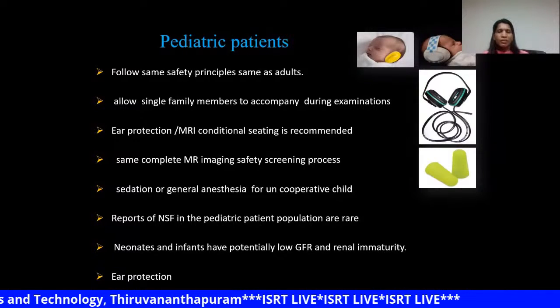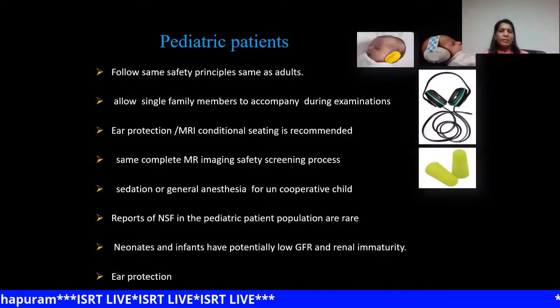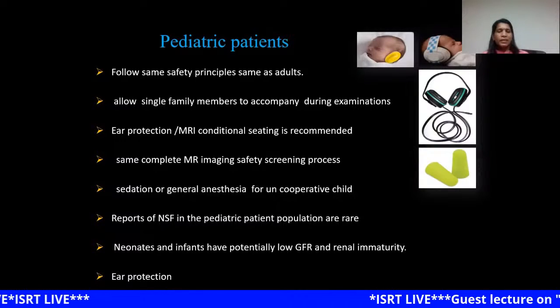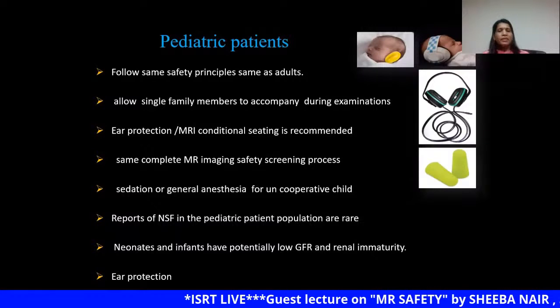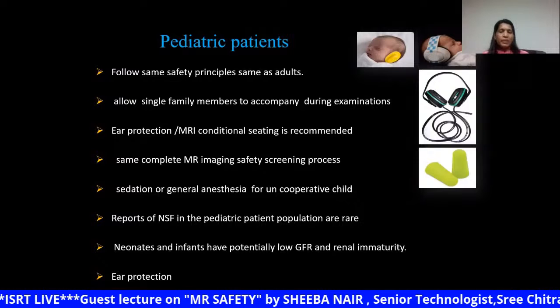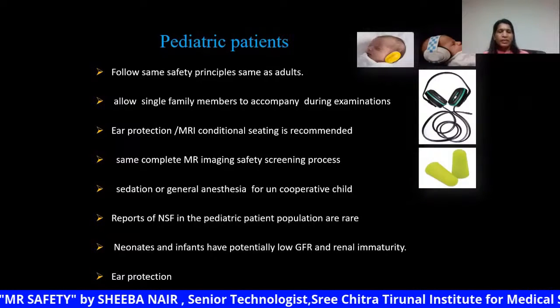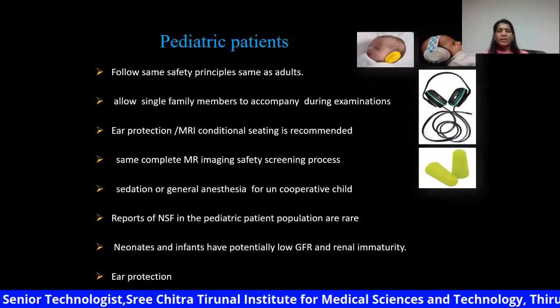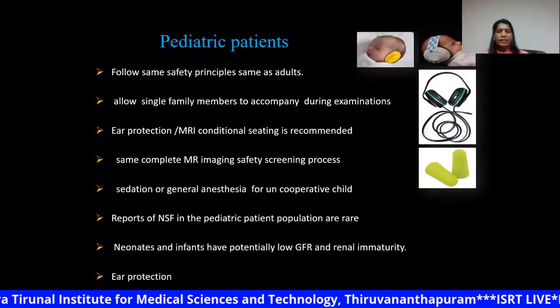In such a situation, we have to screen the accompanying person in the same way as the patient, and give ear protection and MR conditional seating to the accompanying person. For an uncooperative patient, we can give sedation or general anesthesia, which should be done by a group of trained personnel.